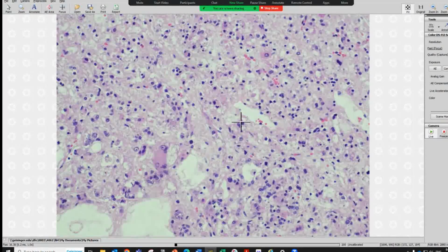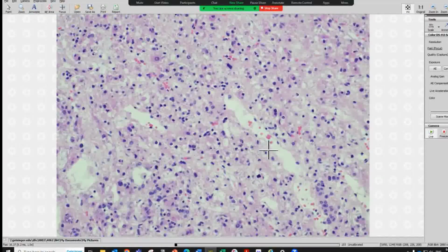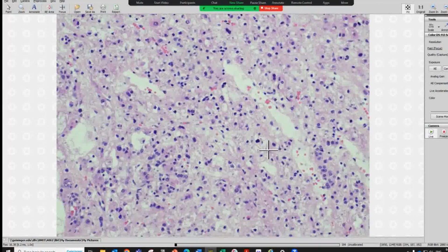So these are perivascular epithelioid cells. So this is AML, but the epithelioid variant. We call that epithelioid PEComa or epithelioid angiomyolipoma. So when you see high grade features and cells growing in nests, solid growth, epithelioid cells, you need to think of clear cell renal cell carcinoma, chromophobe renal cell carcinoma, and this epithelioid AML.